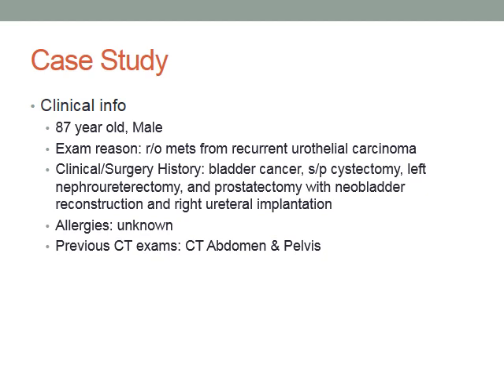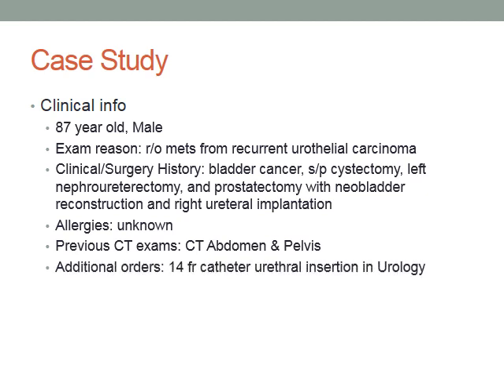He has no known contrast allergies, and he had a previous abdomen and pelvis CT. I don't think his previous abdomen and pelvis CT was related to his current disease. Pre-exam, urology ordered a 14 French urethral catheter insertion in the urology department before coming into CT.